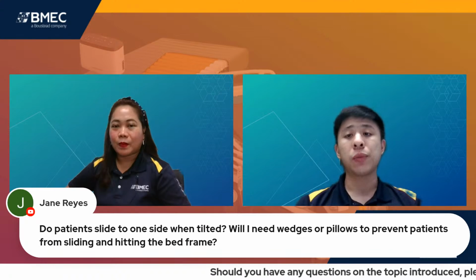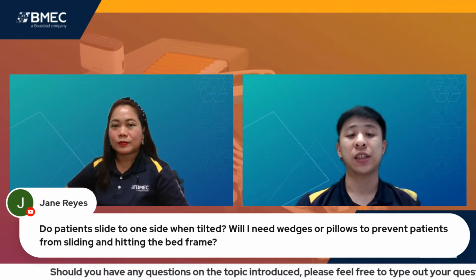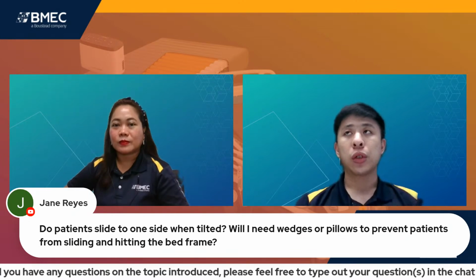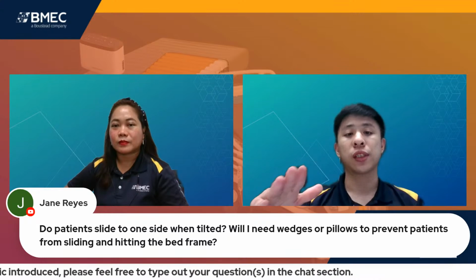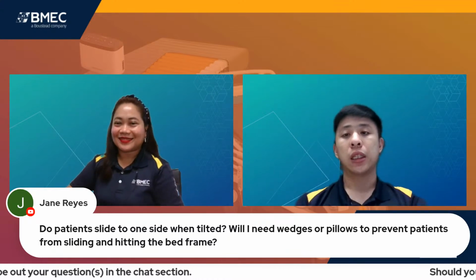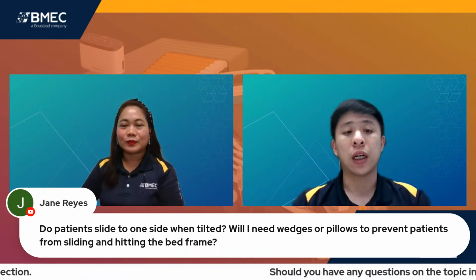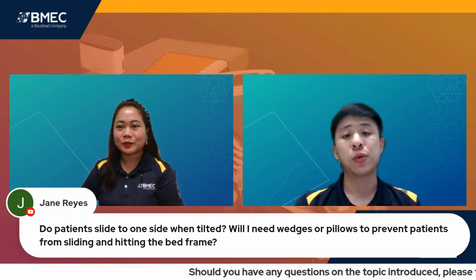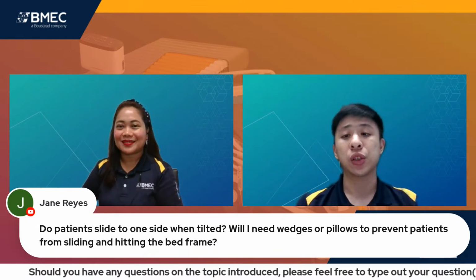When patients make slight movements, they might roll in the direction they are tilted to, so it's not sliding off. It works perfectly well when patients are in a coma or vegetative state, as they do not move and will not slide. But patients who make slight movements might roll down with the slightest movement.